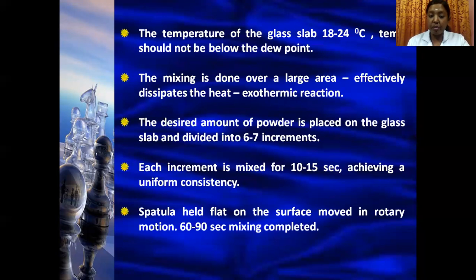Then increment by increment, you have to incorporate into the liquid and mix it in a circular motion on a wide area on the glass slab. Each increment should be mixed ideally for 10 to 15 seconds so that you achieve a uniform consistency.